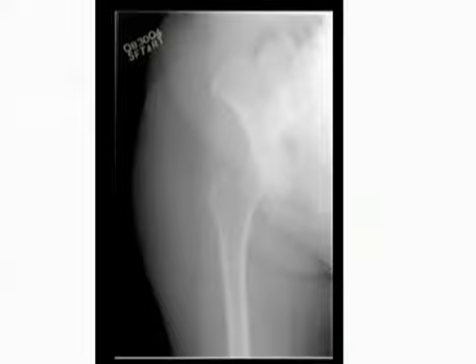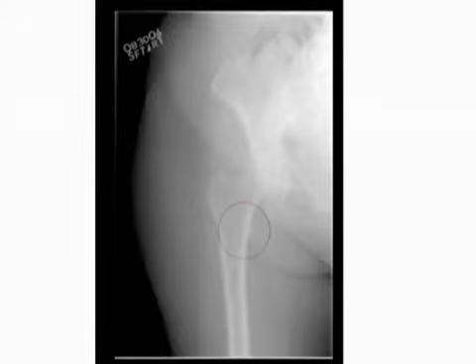The AP proximal femur radiograph should demonstrate all skeletal anatomy of the majority of the femur, with the lesser trochanter not seen beyond the medial border of the femur. Appropriate contrast and density will demonstrate both soft tissue and trabecular bone.